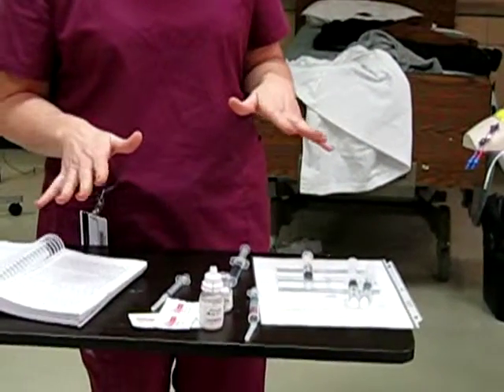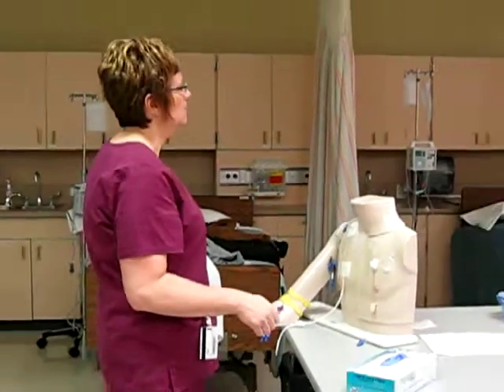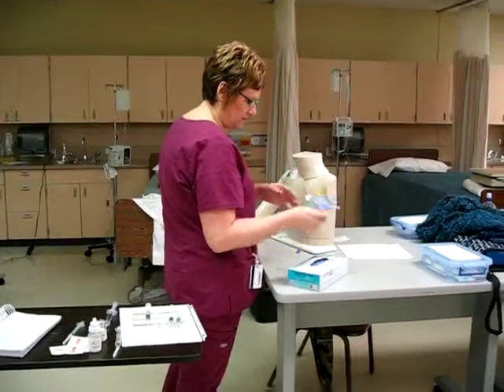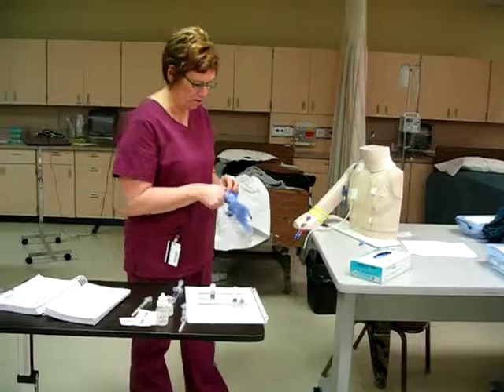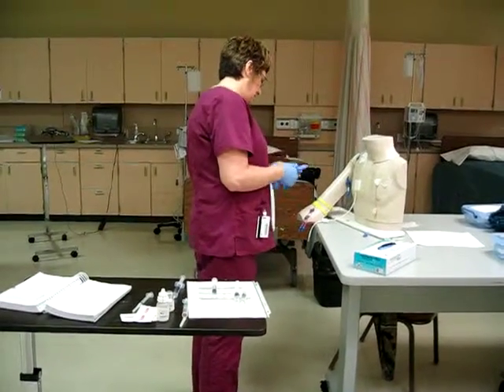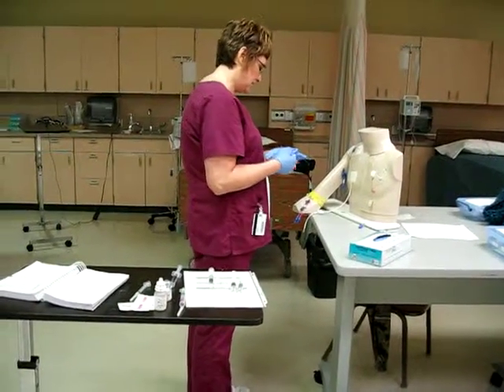I'm going to wash my hands. I'm going to knock on the room. I'm going to allow privacy. I'm going to introduce myself. Hi, I'm Deb, and today I'm going to be giving you Dilaudid with a heparin flush. I'm going to check his name, Pat Smith, and his date of birth. I'm going to check for any allergies.